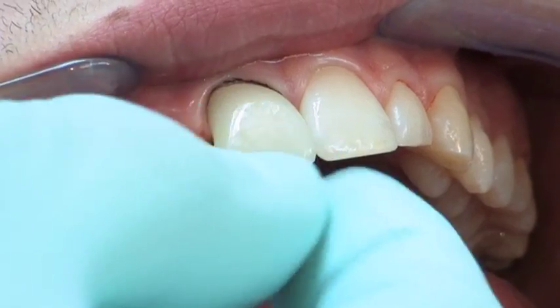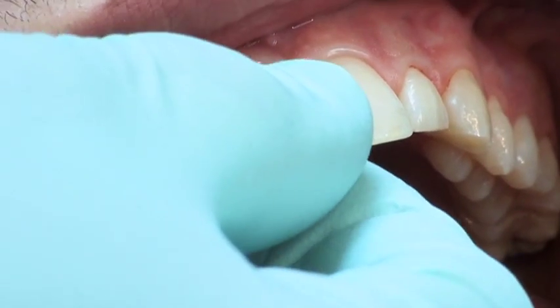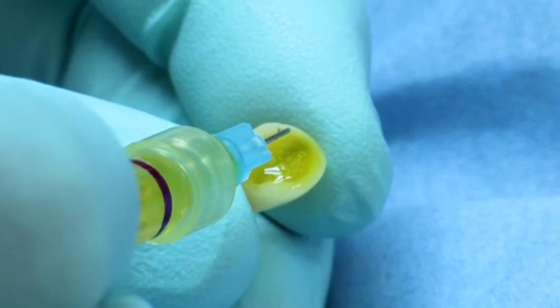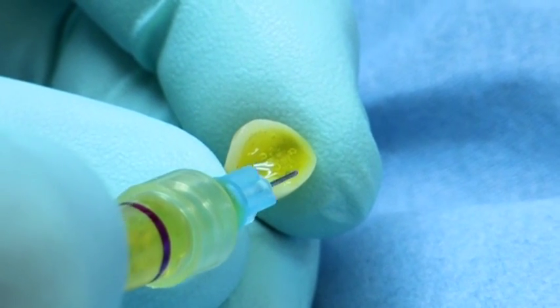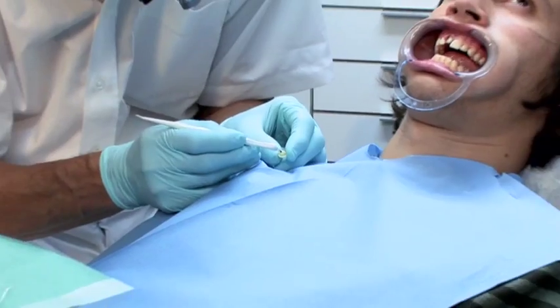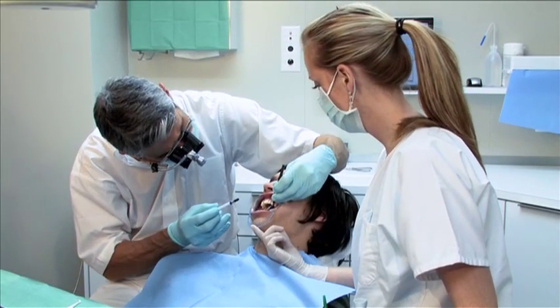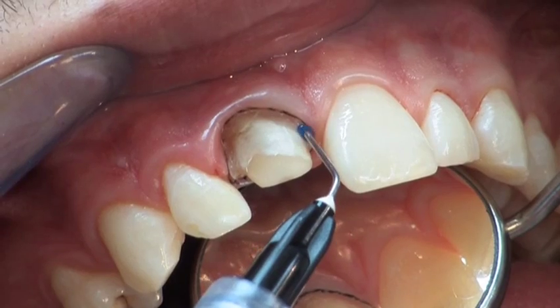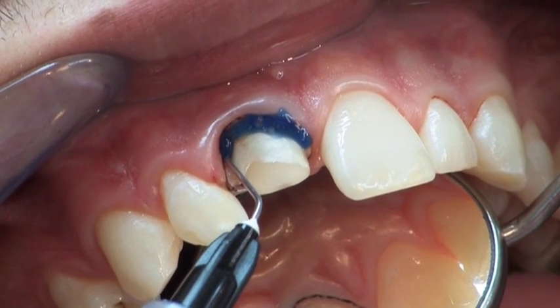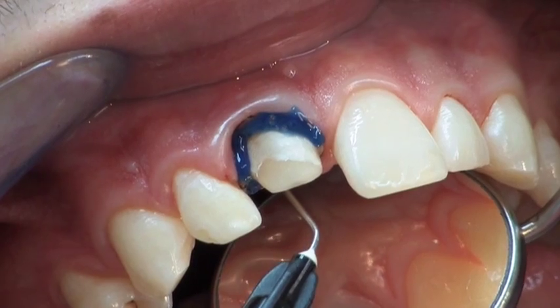The fitting accuracy of the final all-ceramic crown is checked once again. Before cementation, the inner surface of the crown is etched with hydrofluoric acid, cleaned under running water and dried afterwards. The etched surfaces are silanized and thoroughly dried. Etching around the margins of the preparation using 35% phosphoric acid is now performed. The etchant gel is rinsed off thoroughly and the tooth is gently dried.